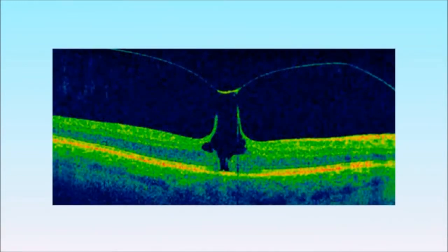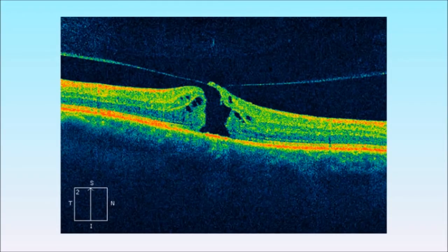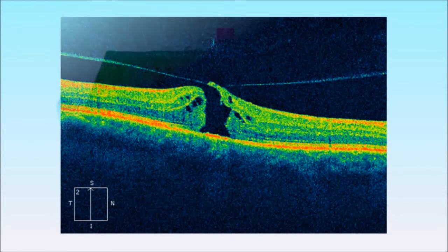In these next two OCT scans, the vitreous has moved forward further still, taking part of the retina with it. This is called a macular hole and results in very poor vision. It is possible to treat vitromacular traction surgically to prevent macular hole formation.